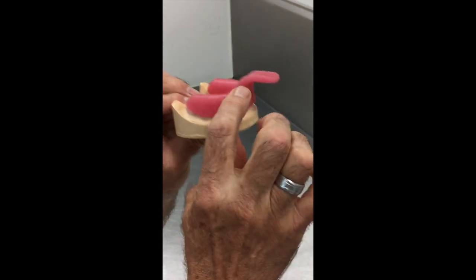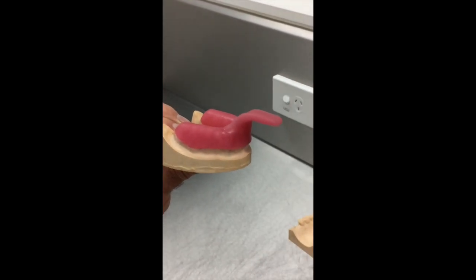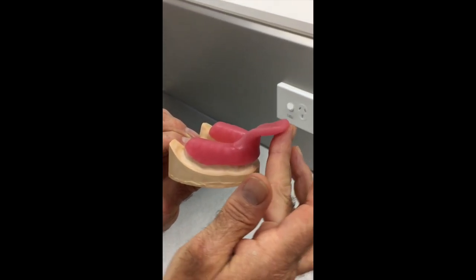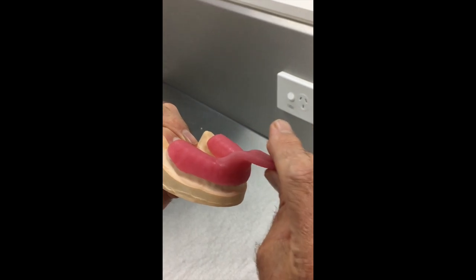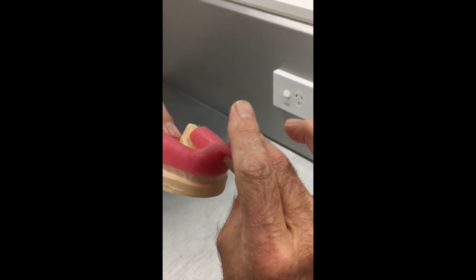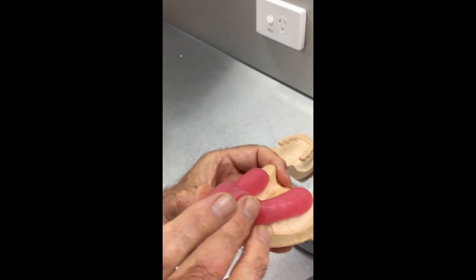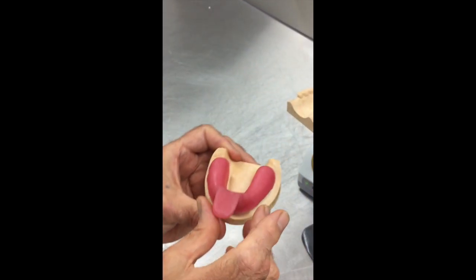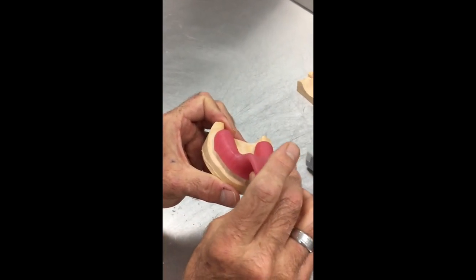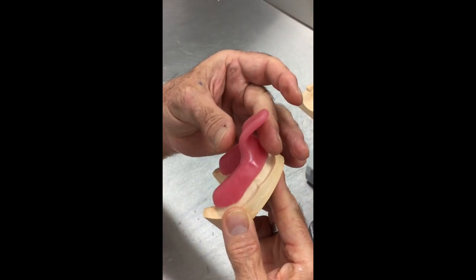So we need this handle just to clear those teeth and to come out like so. And we would like the handle to be parallel to the occlusal plane, because that way we know it's coming straight out of the mouth. We don't want it to be poking up like that and interfering with the upper teeth. We just want it to come straight out of the mouth so that the thumb can grip that and maneuver it, because quite often it's quite difficult to remove those impressions, particularly where there's interproximal areas where the impression material has seated in there. Okay, so there's our handle and the shape of the handle, like so.